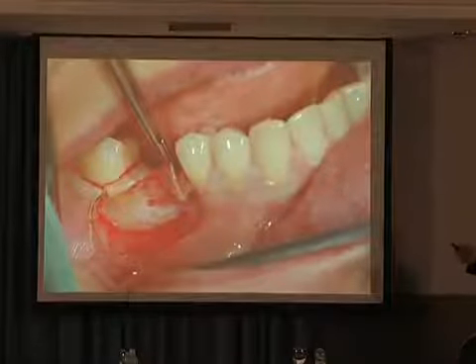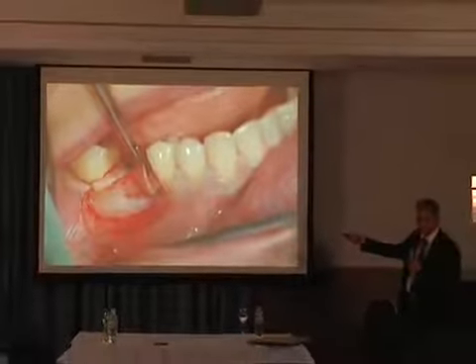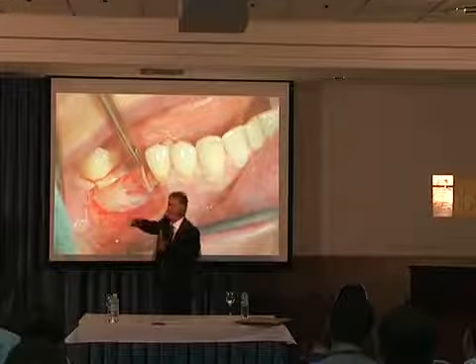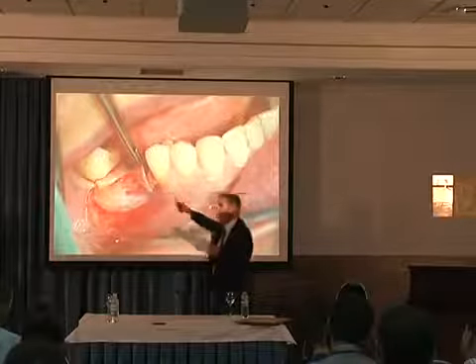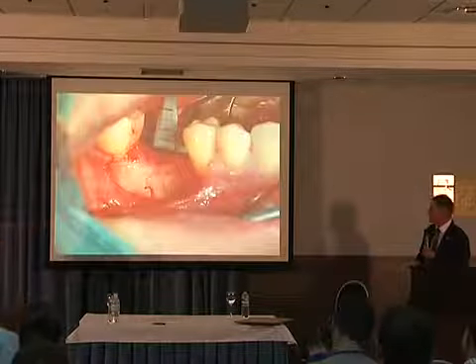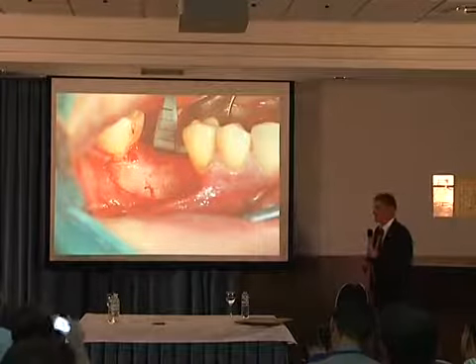And we are going to create the area of keratinized attached mucosa around the implant at the same time. This is called vestibuloplasty Edlan Meisha modified Kaz. Who was the guy from Russia? Kaznijian. Kaznijian plastic. А, Казанджан, да. Sorry, Казанджан. Значит, здесь они начинают заниматься подготовкой именно мягких тканей, именно слизистой оболочки, согласно вот этих модификаций, которые предложены доктором Казанджаном.